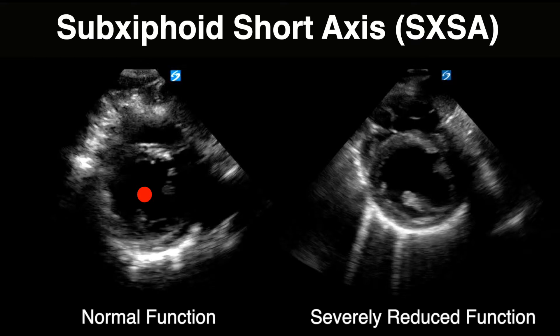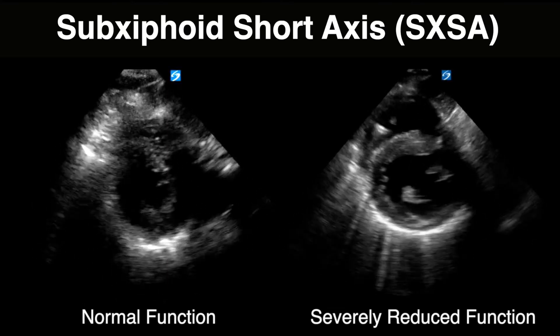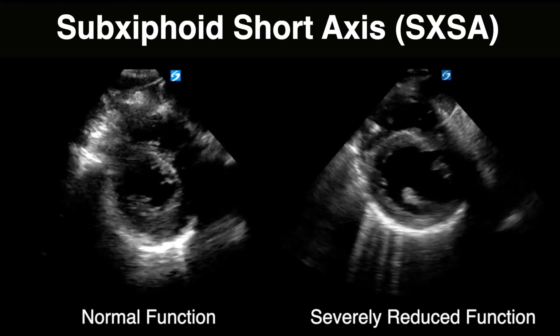The subxiphoid short axis view uses the same red dot concept — watching how much the LV walls collapse toward the center. This is often a great view in COPD patients or those with lung disease where the parasternal short axis is difficult to obtain. Comparing normal versus severely reduced EF here: normal function shows good wall collapse, while the severely reduced example shows the walls barely moving toward each other.